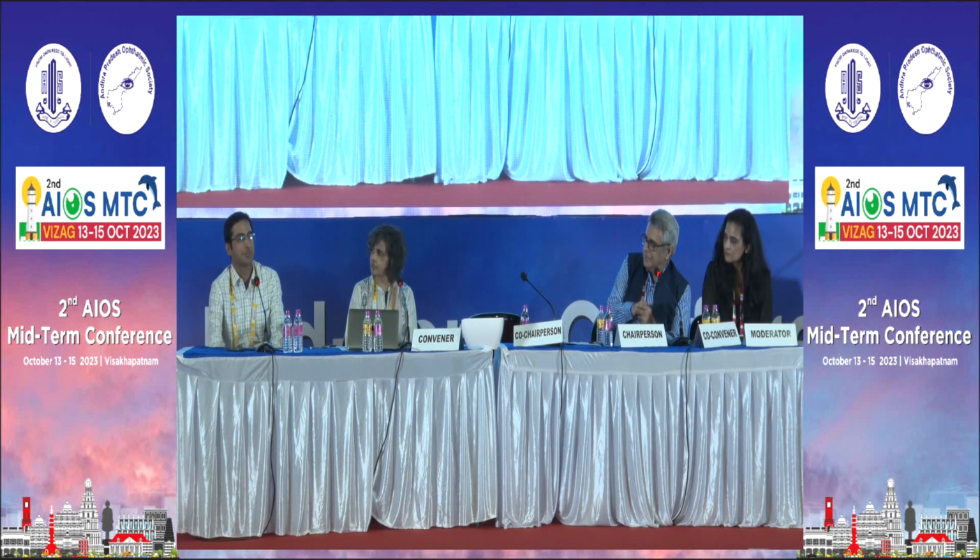Two places. One, when we are looking at subclinical cases. Second, when we don't want to repeat an FFA, we can do an OCT angio.